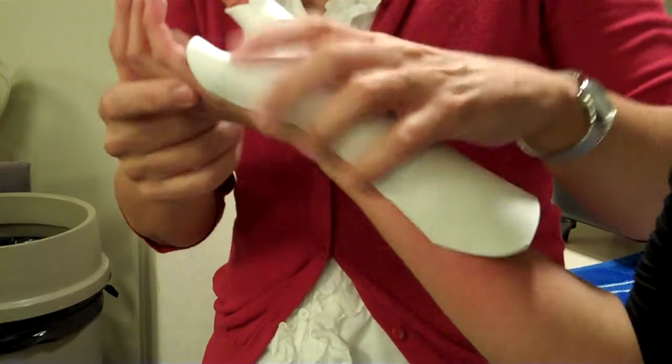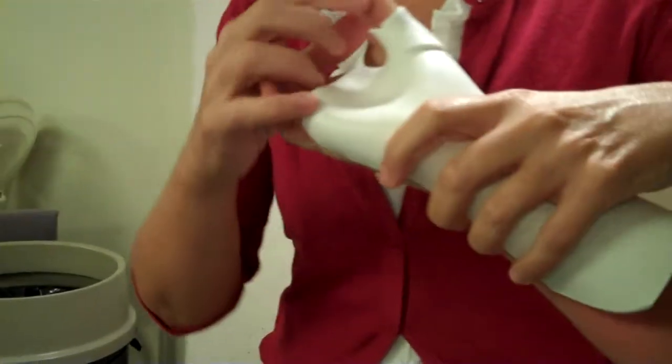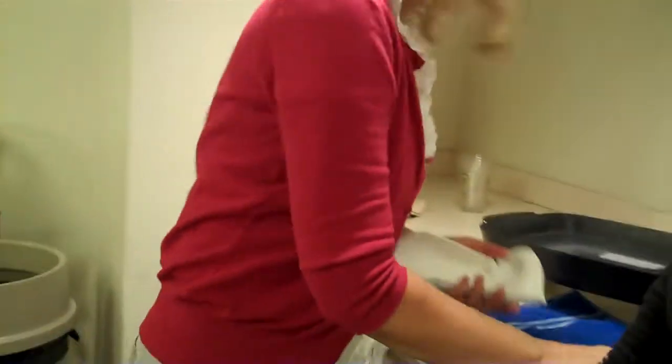So don't make them so tight that you can't. Forgot the Vaseline. Don't have the Vaseline. I'll let you pull it off. Now, if you had a surgery patient, you couldn't be tugging on this much. That's why stockinette's important.